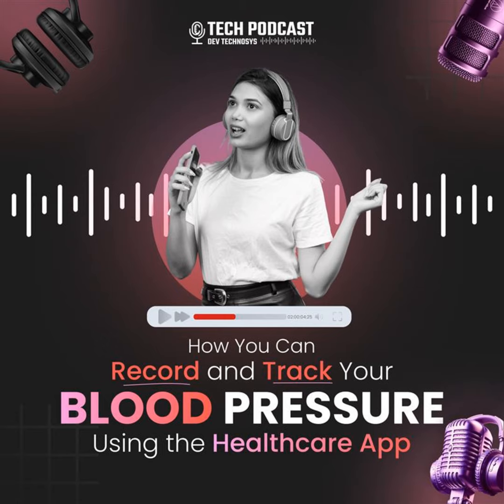Let's say someone just downloaded a healthcare app. What's the first step they need to take to start tracking blood pressure? The first thing is profile setup. Most healthcare apps ask for basic health information like age, gender, weight, and existing health conditions. This helps the app personalize alerts and recommendations. Once that's done, users can navigate to the vitals or blood pressure section of the app.